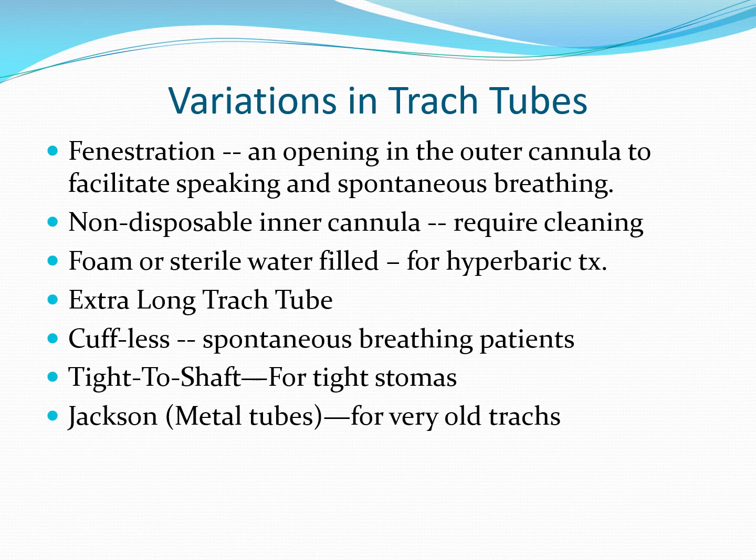As that patient is brought down to 3, 4, 5 atmospheres, the barometric pressure at 3 atmospheres is 3 times what it is at sea level. So the pressure being exerted on that cuff will be greater. The cuff will tend to want to collapse, and there will be more air or tidal volume escaping. So one of the guards against that is using a sterile water filled or a foam cuff. There are other reasons as well why they're used.